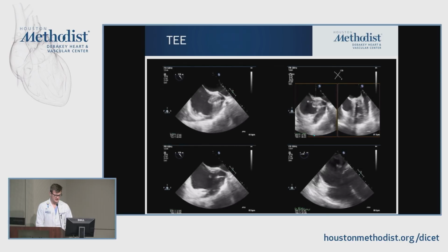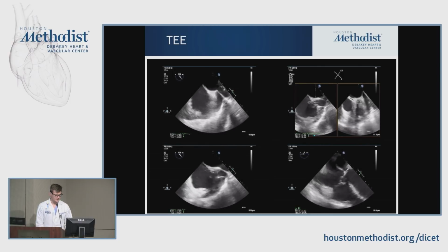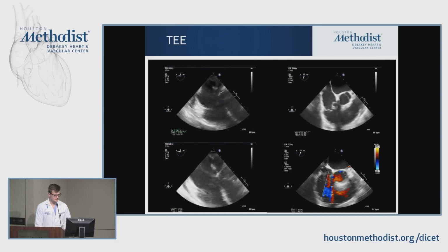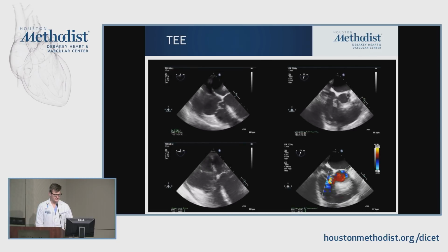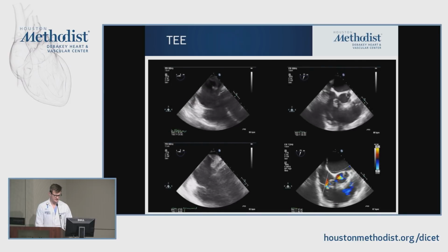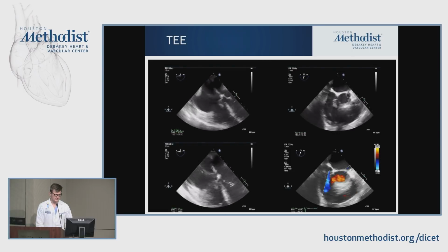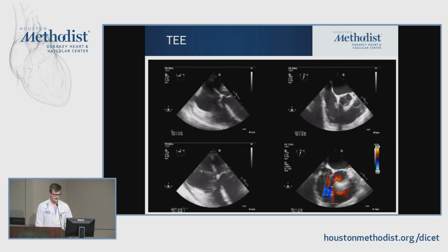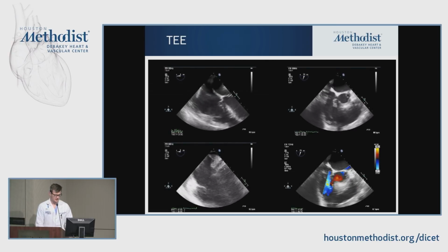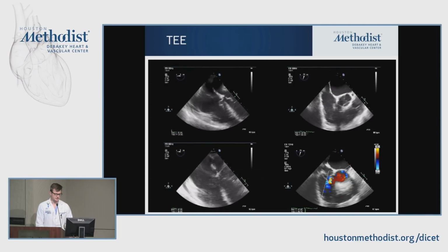the imagers didn't stop and proceeded with further investigation of the tricuspid valve, which they saw, and did more focused interrogation of the tricuspid valve, and confirmed this windsock appearance of the septal leaflet of the tricuspid valve, which usually represents some underlying flow in the interventricular septum. So they interrogated the interventricular septum with color Doppler, but no significant flow they saw.